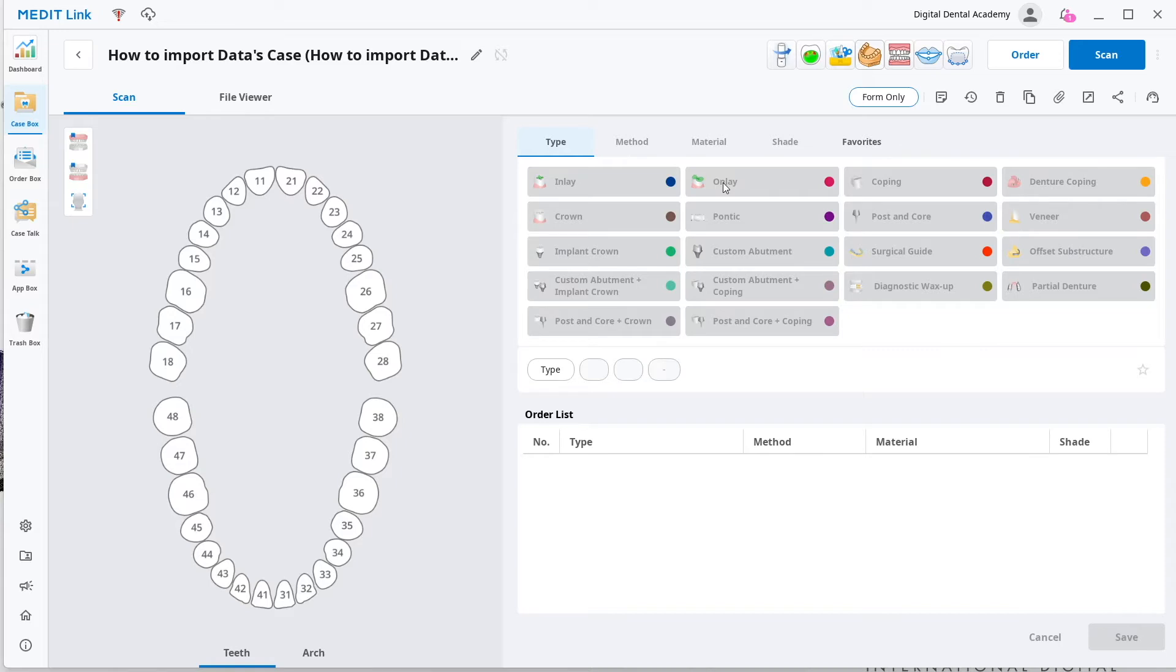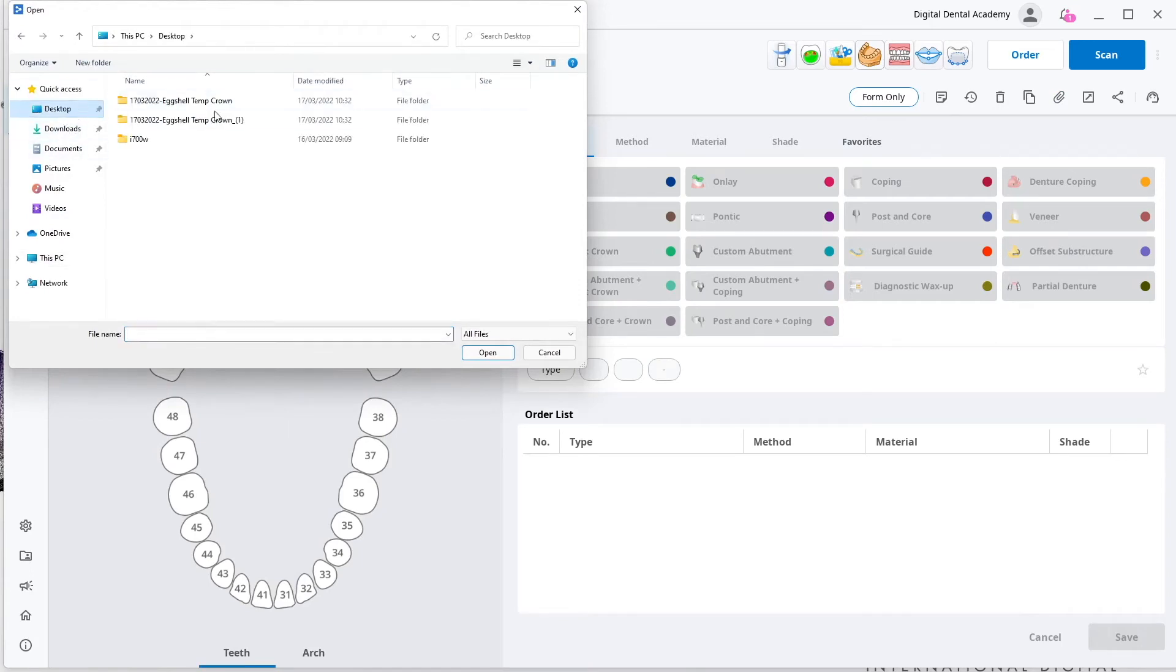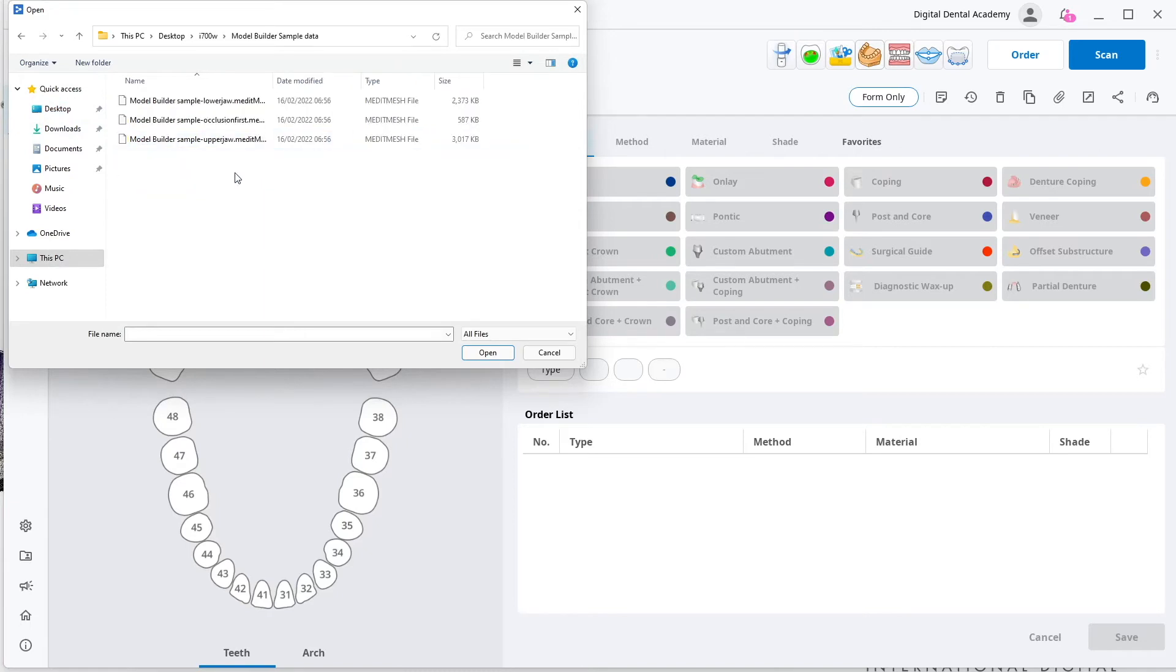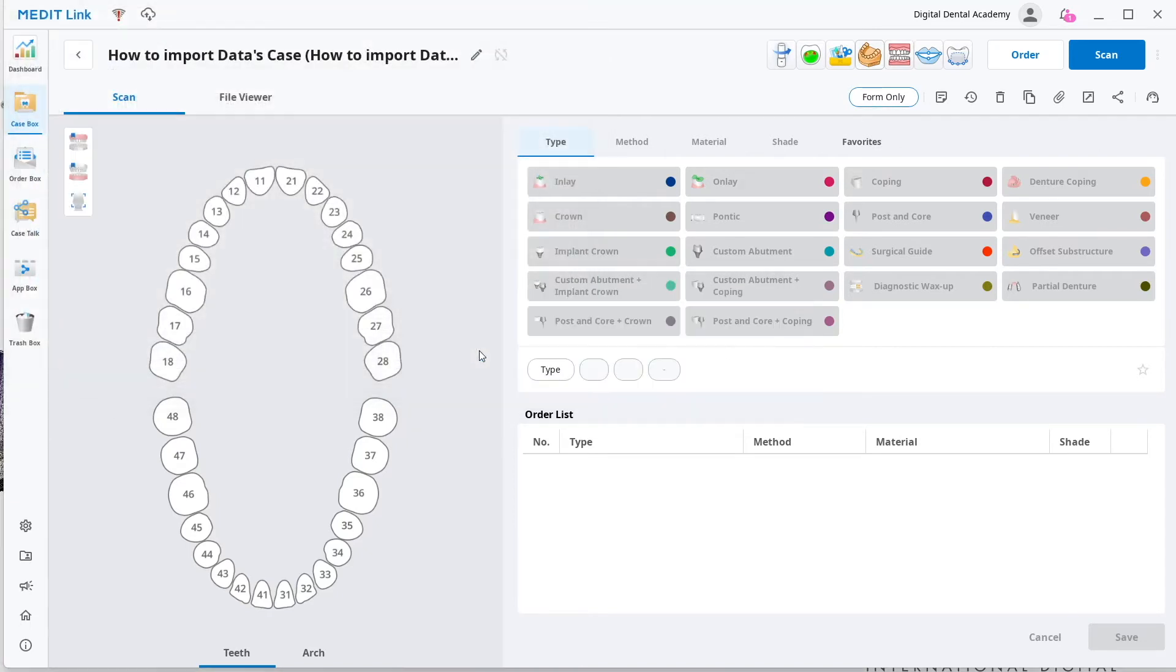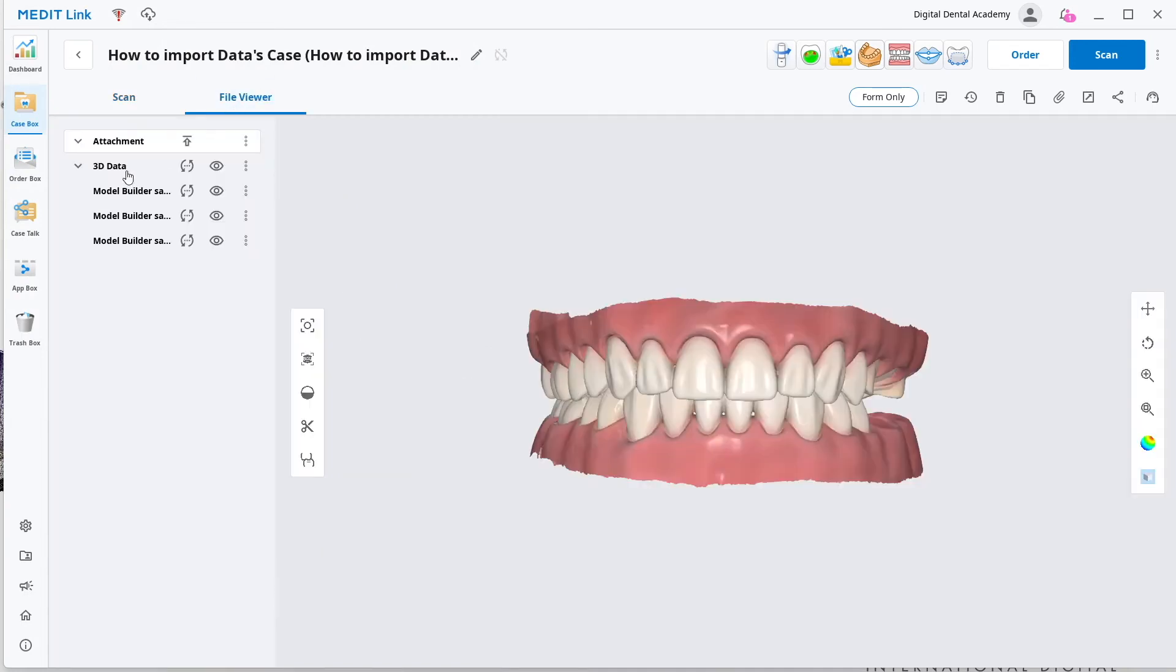Very nice and easy, and there are some beautiful apps. Let's click this attachments button and here I'm just going to go to the desktop, go to one of these folders - let's go to the sample data - drag those files in, and then if we go to file viewer you can see they're there.